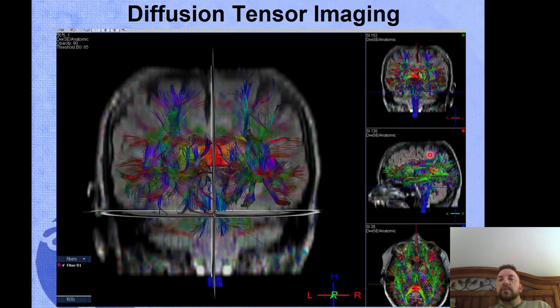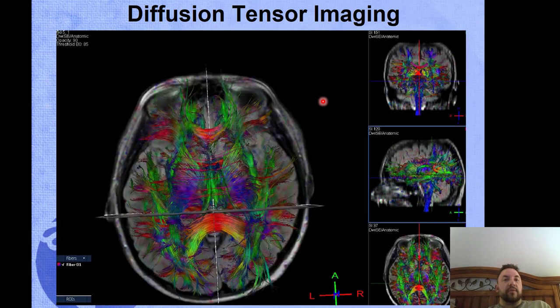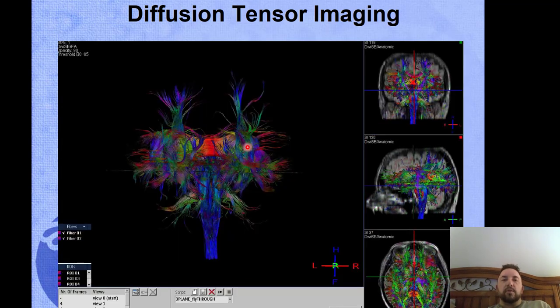So the fiber tracts within the brain, and this is a huge application if you have a patient with, let's say, a tumor, a mass, or some effect like that where surgical intervention can help the patient, but you want to make sure the doctor doesn't touch any active fibers, which will control function. So yeah, it looks great to have some nice color maps, but it's really important from a surgical intervention and surgical planning aspect. And of course, post-processing is always fun.